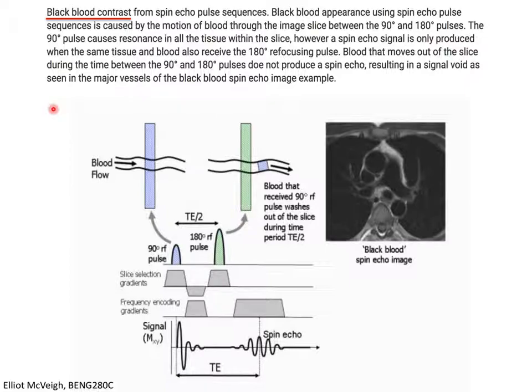An interesting form of imaging contrast in cardiac imaging occurs when you use a spin echo image in and around the heart or in and around vessels, such that the vessel is penetrating the two-dimensional imaging plane. So here is the ascending aorta, this is the descending aorta, right? So blood is going away from us in this region, and it's coming right at us in this region, right?